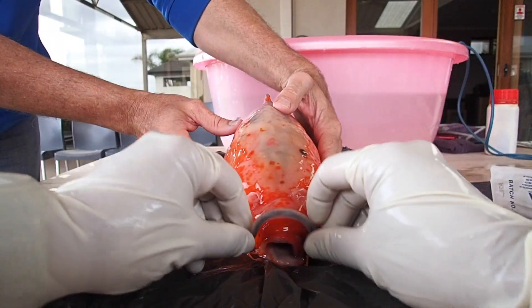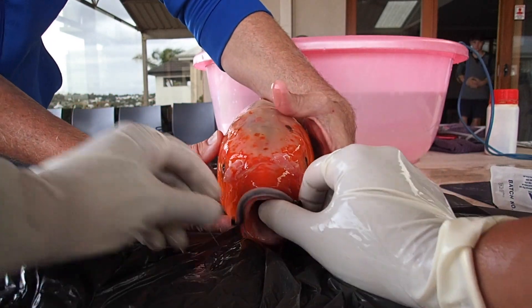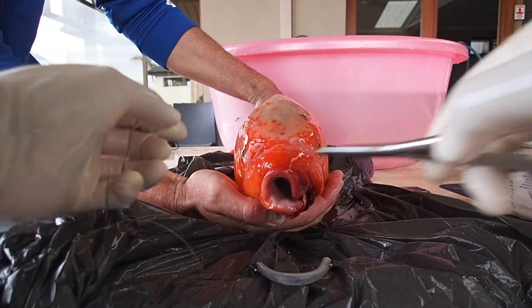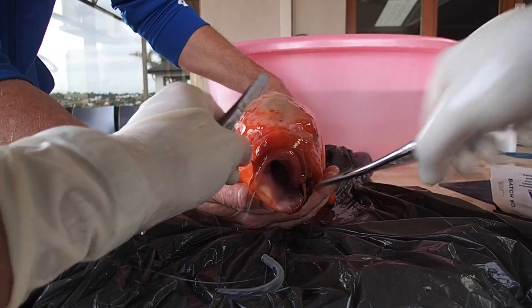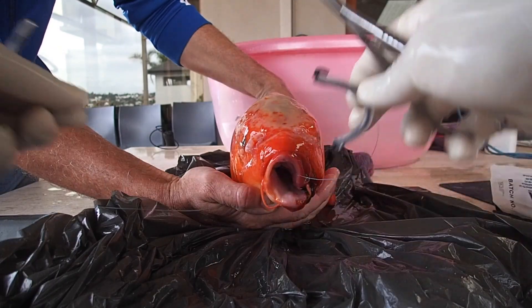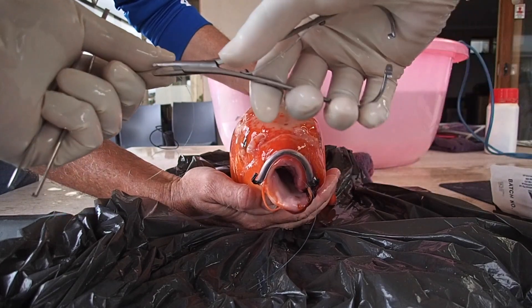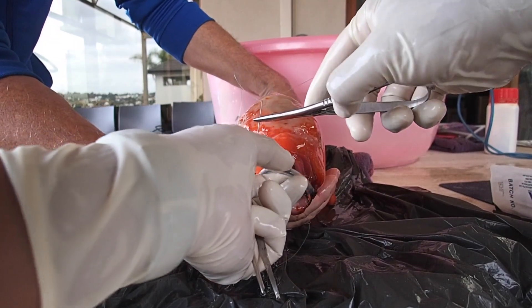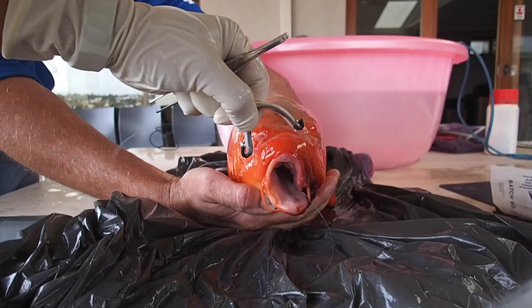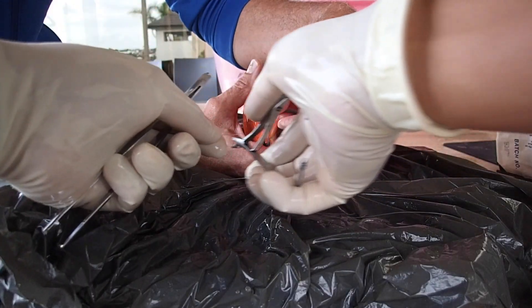We're positioning Harry here so that we can attach his mouth brace. I'll probably go all the way around the whole mouth. So, we're inserting the first lot of sutures. We're using a simple interrupted pattern. The first one is to anchor the mouth brace in position. We go through the soft tissues behind the pre-maxillary bone and then through the silicone of the tubing around the splint.